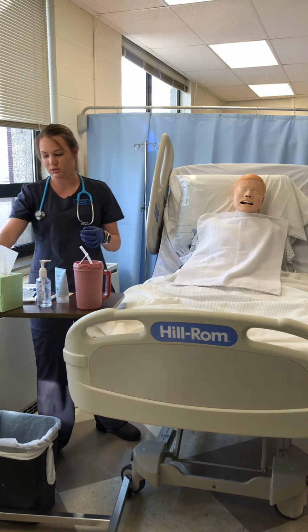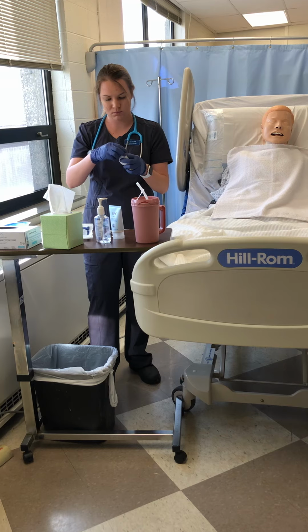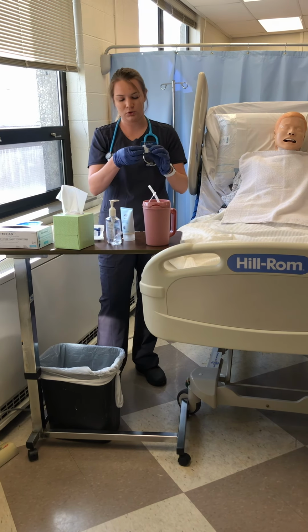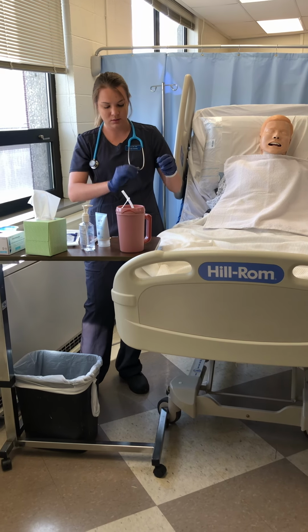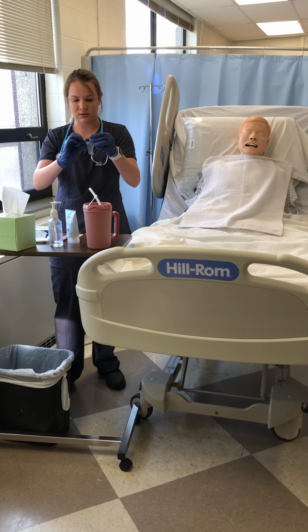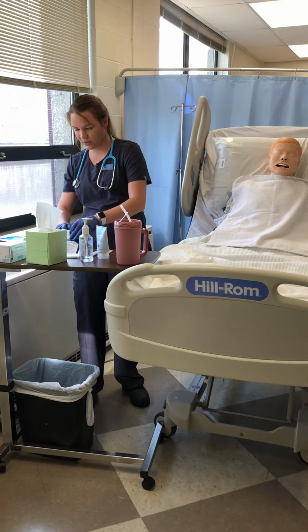Towel on my patient's chest. Going to get my pH strips ready. Going to tear off 4 pieces of tape, and I would make sure my table is clean before I would place them there. And I have one long piece that I'm going to tear down the center. I'm going to open my tube and get my tubing out.